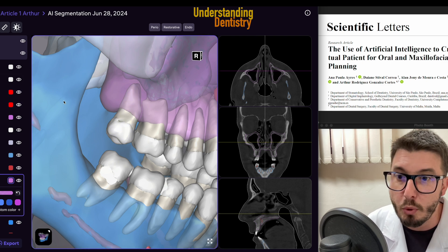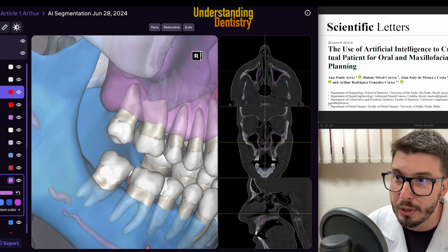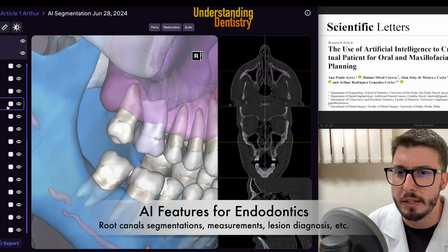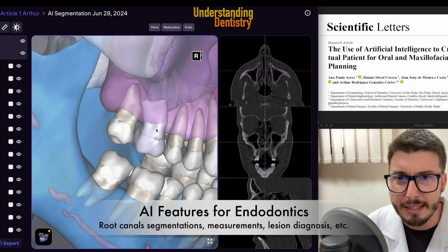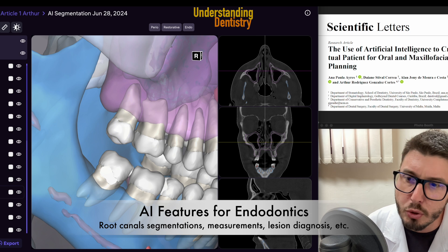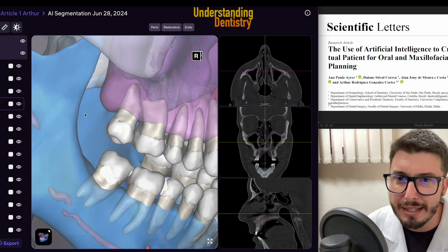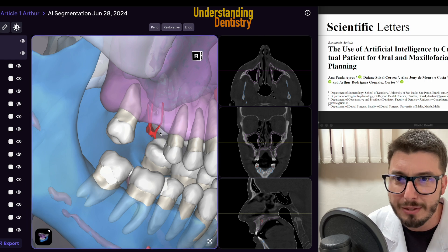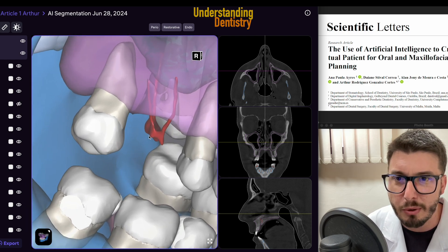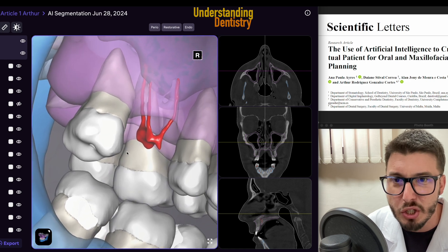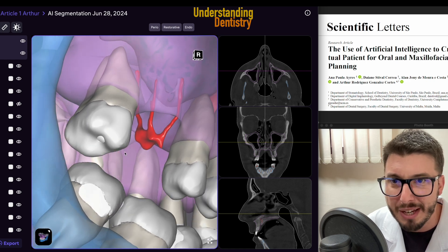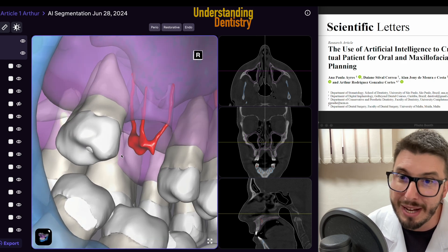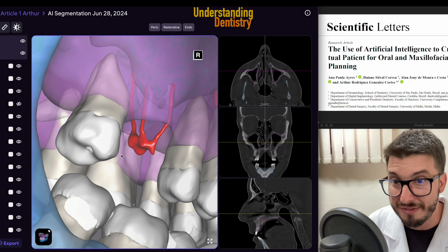Let's see what is possible to do here — which treatments we can simulate. Let's imagine you are going to do an endo on the 1.6. I want to see the root canals, so I'm going to remove the tooth but keep the root canals visible. Look how nice this image is. We can see that we have three root canals, and of course the quality of the CBCT will also affect this.